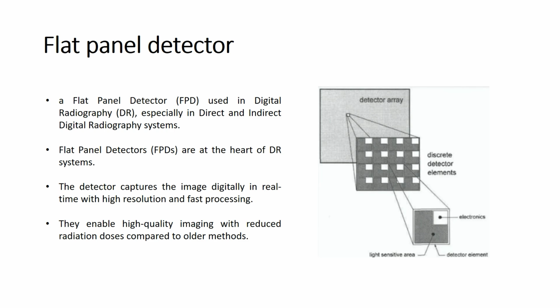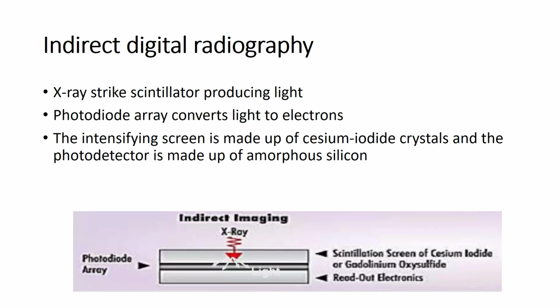Because of its fast processing and best resolution, it is generally used in wildlife radiography, in human and animal radiography, in dental radiography, etc.